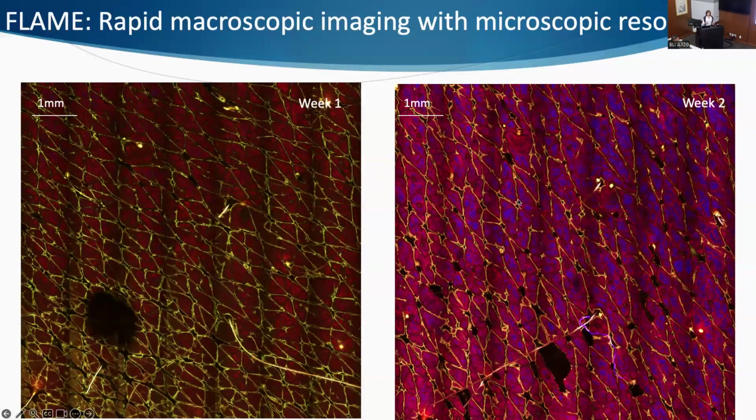We can just use a landmark on the skin, like a solar spot, and tape this magnetic ring close to that landmark. Then we take a reference point like this hair over here, which is very likely the same hair based on its morphology and the surrounding area.